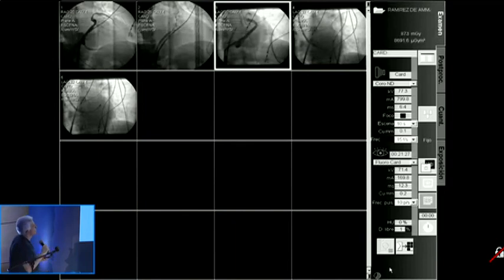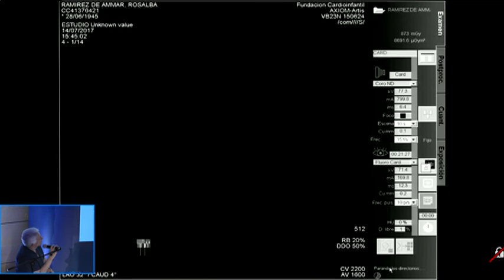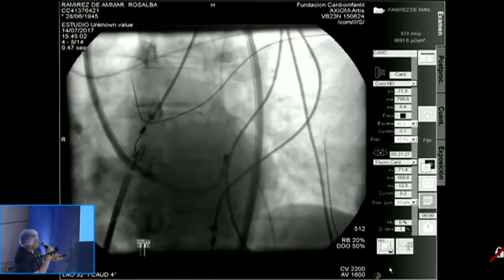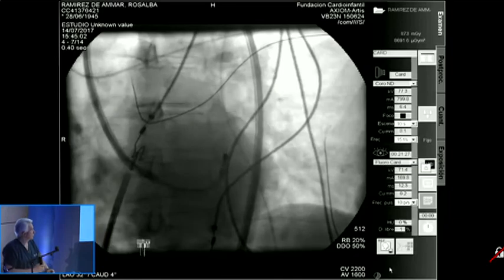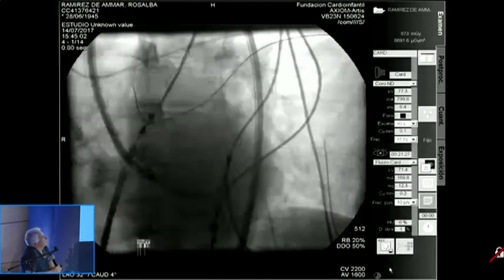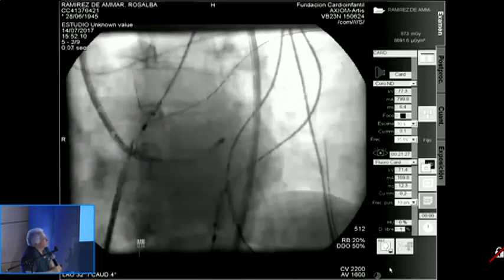The best way for us to have good contact is to try to use a sheath. And you'll see that the sheath goes all the way down with a dilated aorta, and it helps us maintain the catheter in good contact. This was the fluoroscopy where we ended up doing the successful lesion in this case.